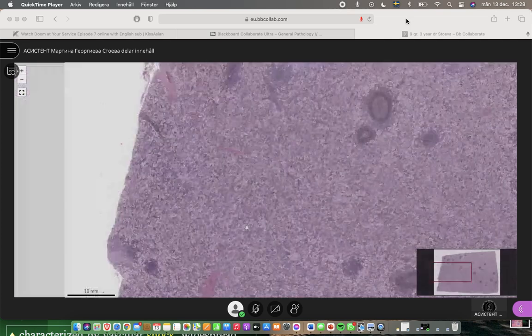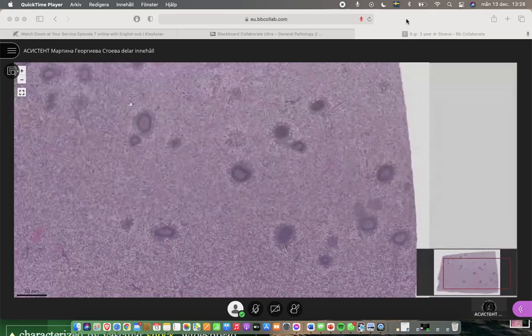And the other characteristic finding in the spleen is the trabeculae, these eosinophilic structures. When we zoom in, we can find their components: smooth muscle cells and fibroblasts. Again, characteristic only for the spleen, but not found in the lymph node. And after we say that the specimen is from the spleen, then we focus on the pathologic process, which is seen elsewhere here on the slide.